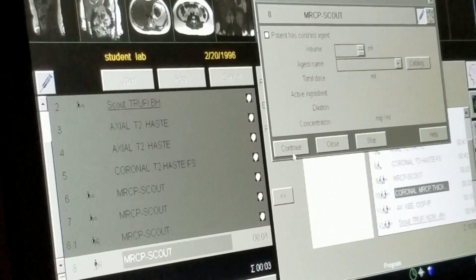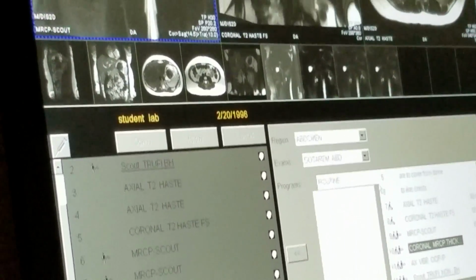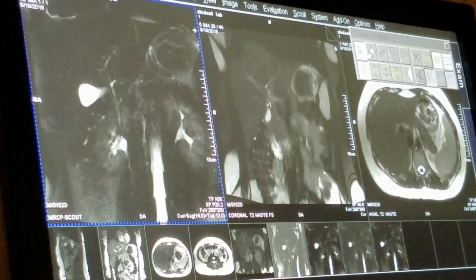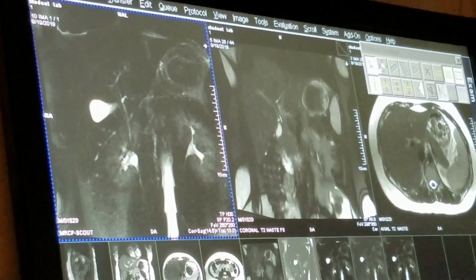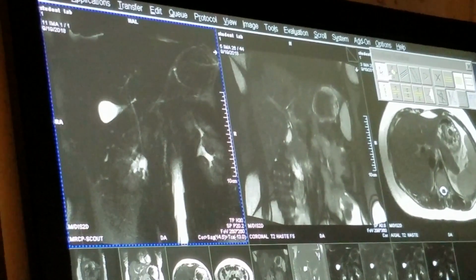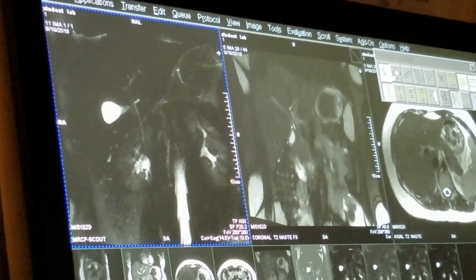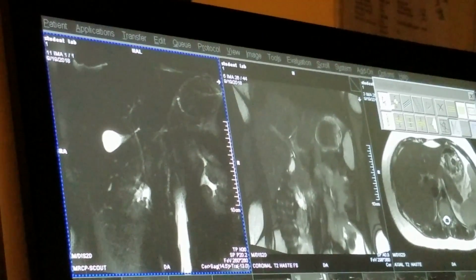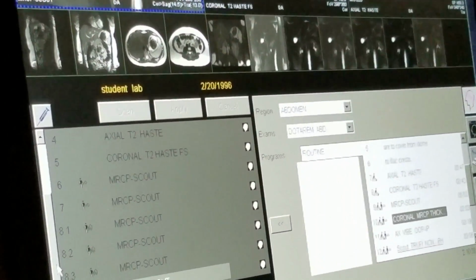Again, please take in a breath. Hold it. Breathe. Take in a breath. Hold it. Breathe. Take in a breath. Hold it. Breathe. So once you run it the 5 times and you're happy with it, you can just hit skip or close and it will stop it. Okay?